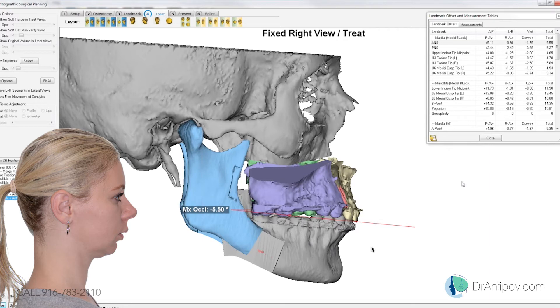Yeah, I think that's pretty good right there. Rest with the chin. So that Pogonion is coming forward 15.8 millimeters right now — Pogonion 15.8. Yes.